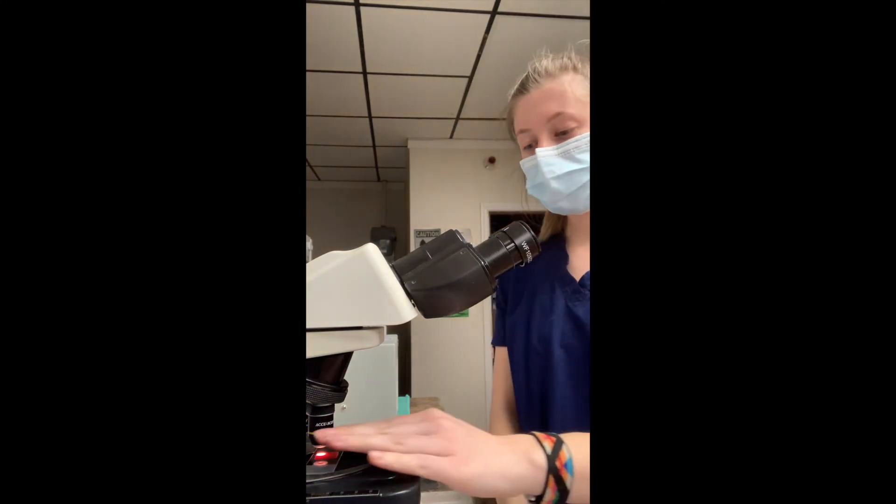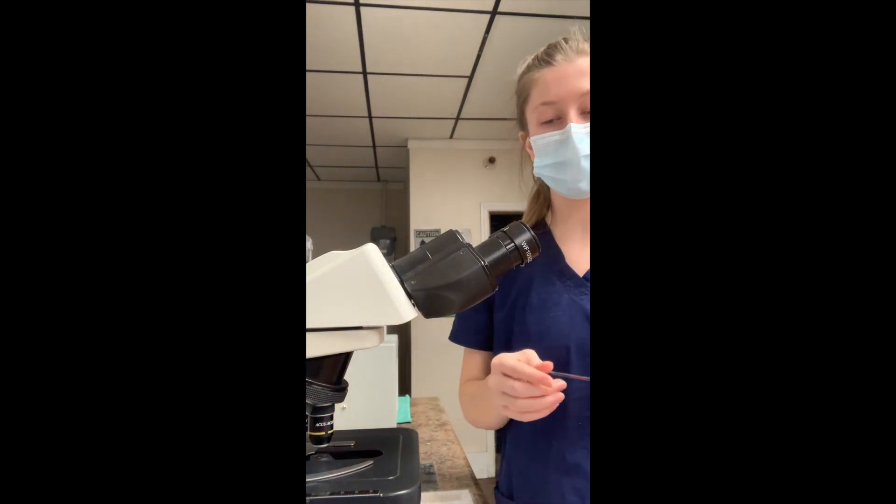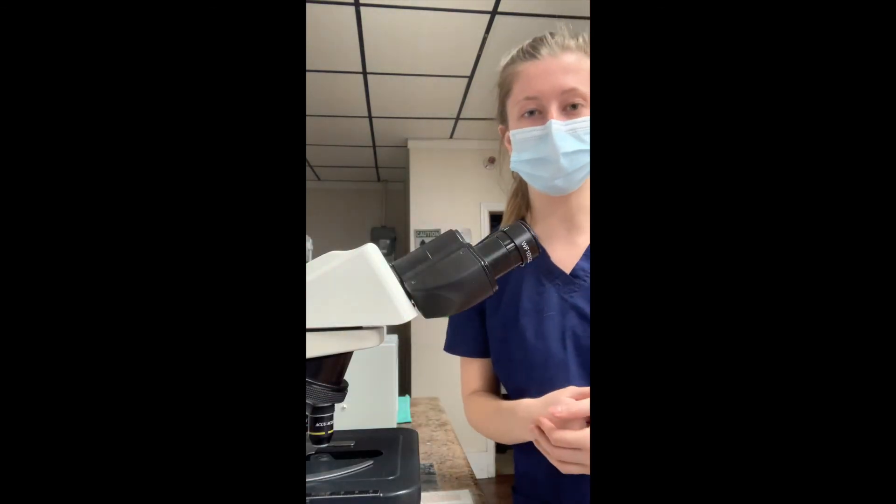Alrighty, so I've completed looking at the slide. I didn't see any movement, so I'm going to go ahead and notate this in the patient's record. And that is how you perform a direct smear to check for microfilaria.